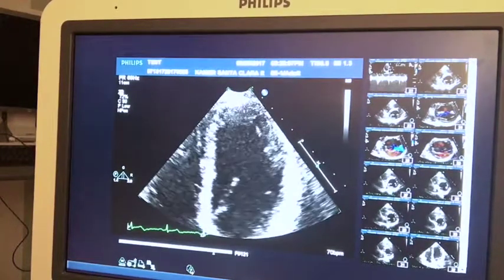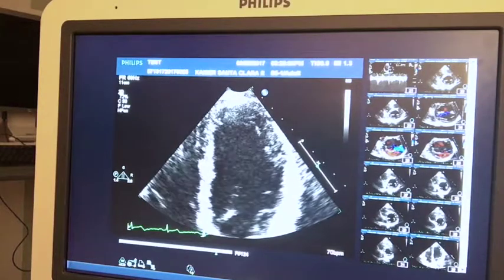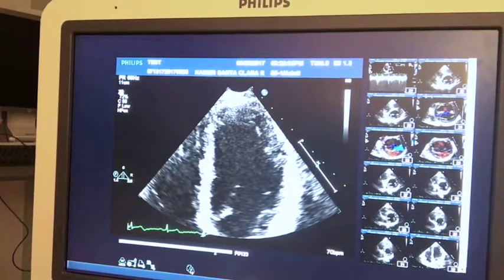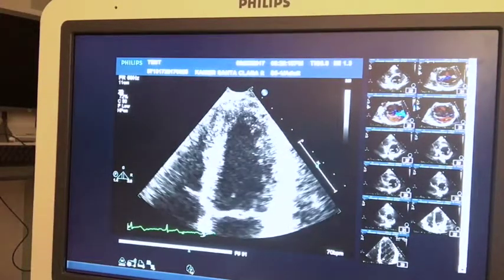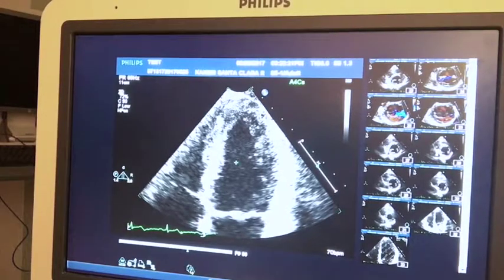and I go to a diastolic view, which is the largest volume view of the left ventricle, and I'm going to walk through and do a Simpson's tracing of the left ventricle during diastole. And I want to go from the hinge points of the mitral valve all the way to the other hinge point on the other side of the mitral valve when I do that tracing. And I have the same anchor on my apical systolic view, which I'm doing now.